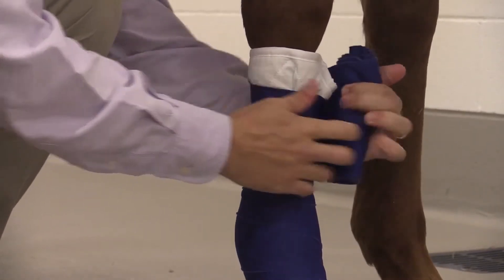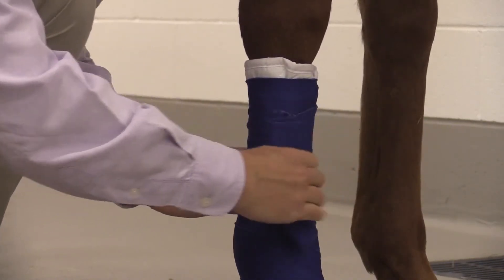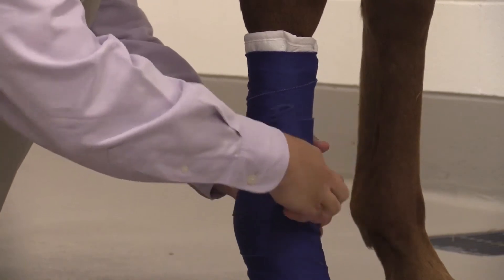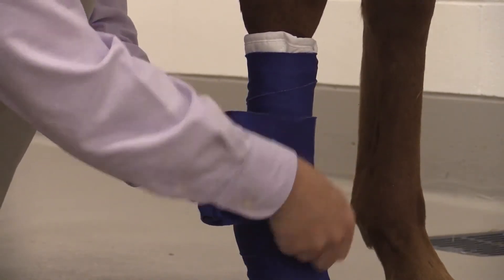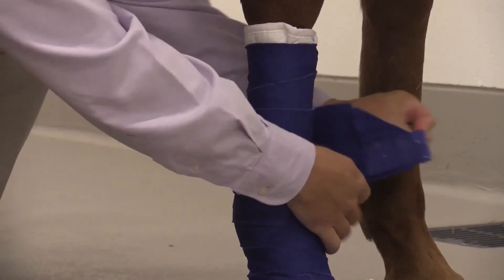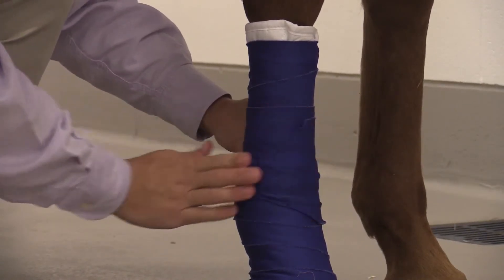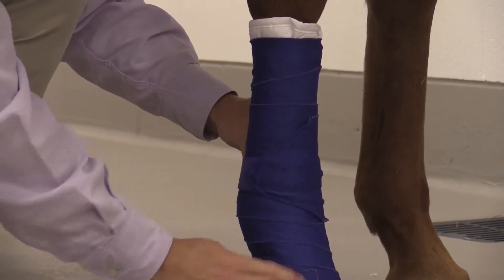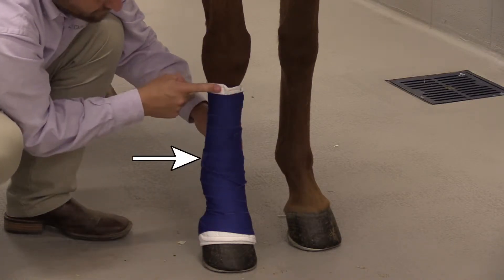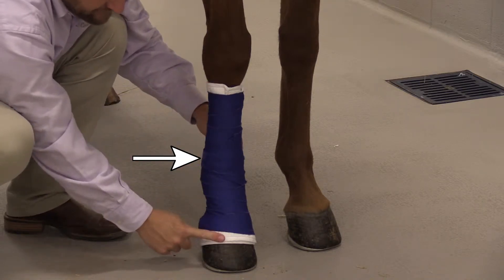Overlapping by half, once we get to the top of the bandage we will again allow a little bit of that quilt to show, so the polo wrap isn't touching the skin — the quilt is our protective layer. The strap is then secured, which is usually a velcro strap. Sometimes adding a little extra tape around the velcro can help hold it so it doesn't unravel prior to replacement.